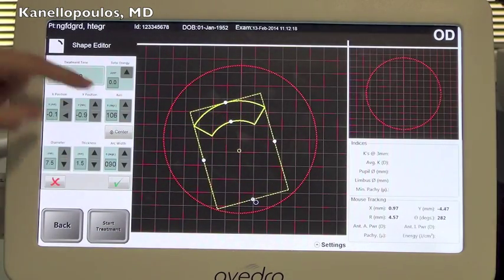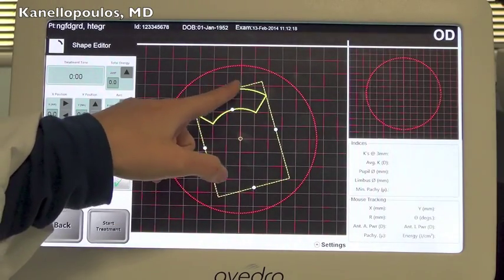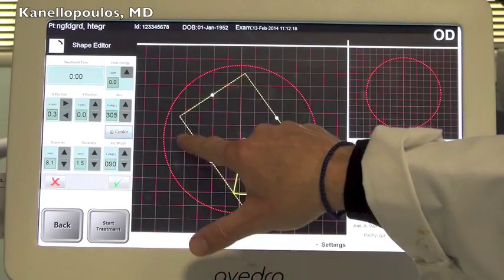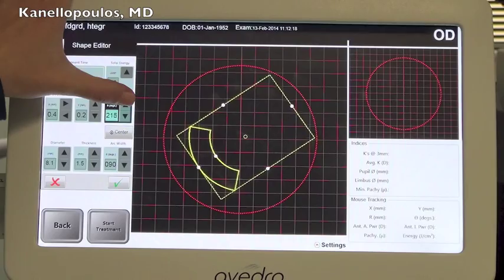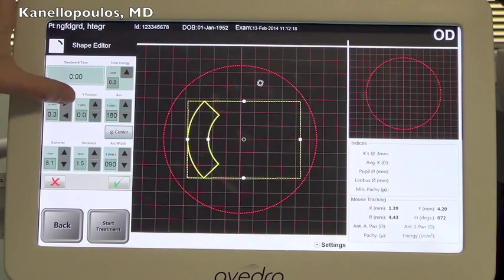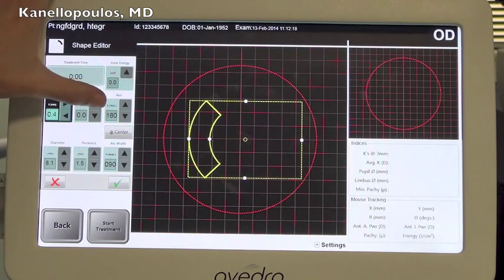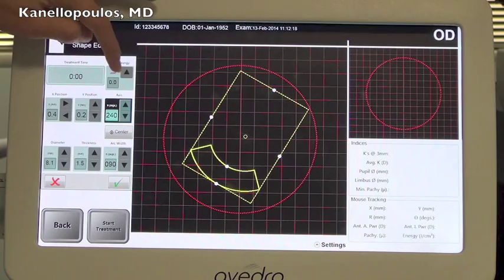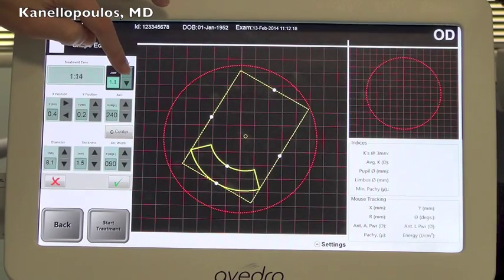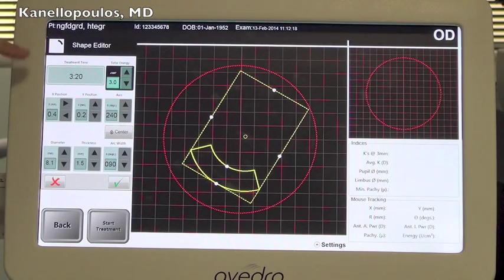This is now just an arc treatment to treat, for instance, over a new or reopened astigmatic keratotomy, and we've published the ability of this treatment, and we're adjusting the arc of that treatment and its axis and its decentration XY, depending on what the data are on our clinical exam and topography. So you can see all the multitude of customability that this device can offer.